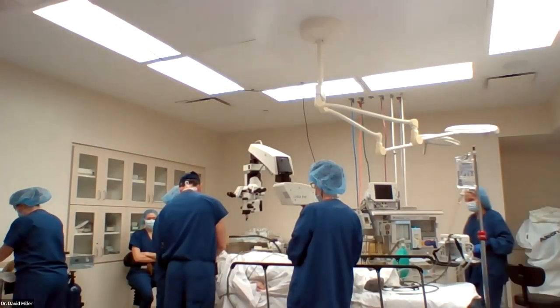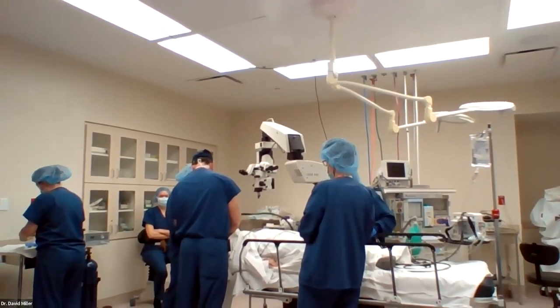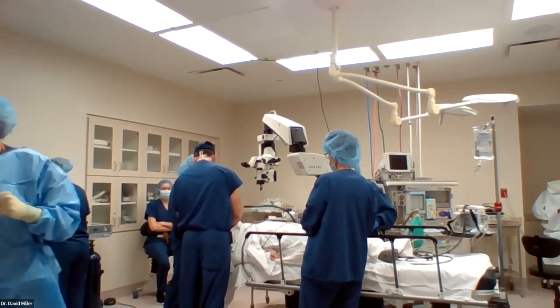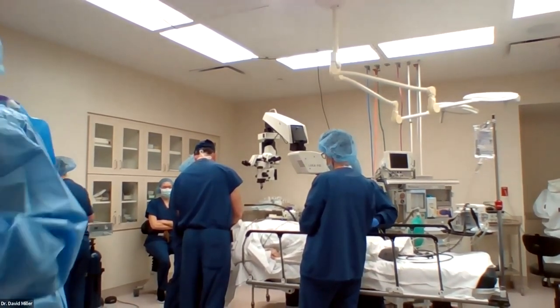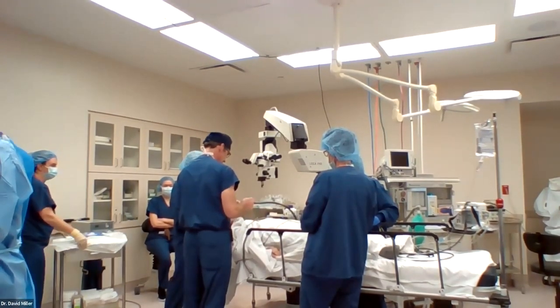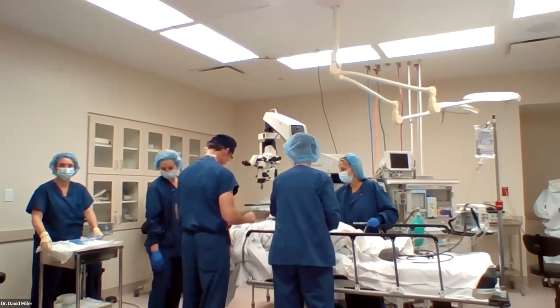Little retrobulbar tension and some burn. This is 5 cc's of some pressure. 5 cc's of Marcaine and Lidocaine mixed 1-to-1. And we saw the globe come up and the lid come down. So I think we have a pretty adequate block. Jennifer, you did great there. All right, we'll get you going.